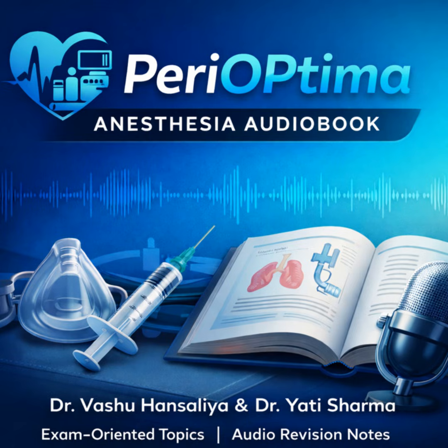That distinction brings us right back to the mechanism of glottic exposure. How do the Macintosh and Miller blades use different anatomical landmarks to get that view? The curved Macintosh blade uses an indirect lift. This is key. So you're not lifting the epiglottis itself. Correct. You place the tip of the blade into the vallecula. That's the space between the base of the tongue and the front of the epiglottis. When you lift, you're actually lifting the base of the tongue. This puts tension on the hyoepiglottic ligament, and it's that tension that indirectly pulls the epiglottis forward and up, exposing the glottis. A very elegant mechanism.